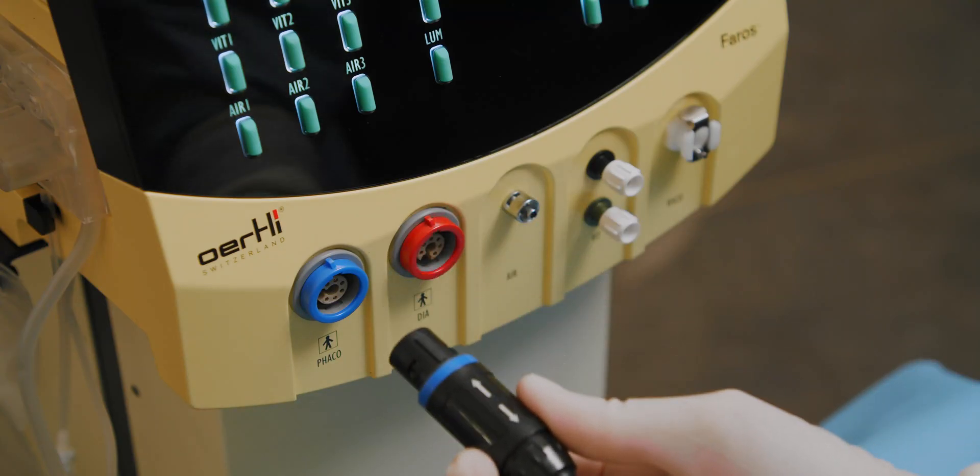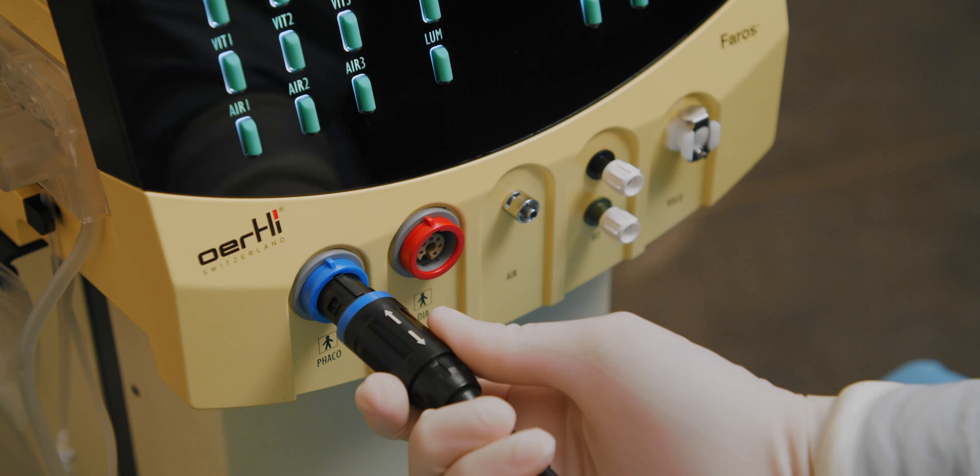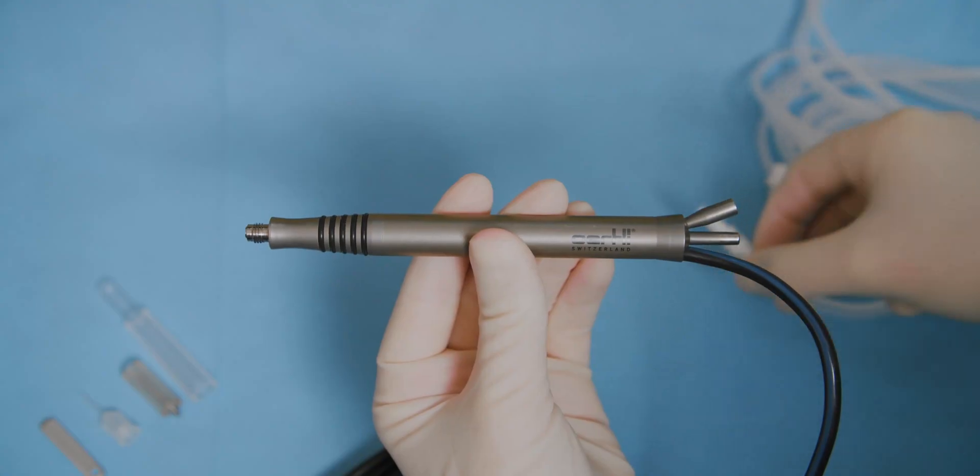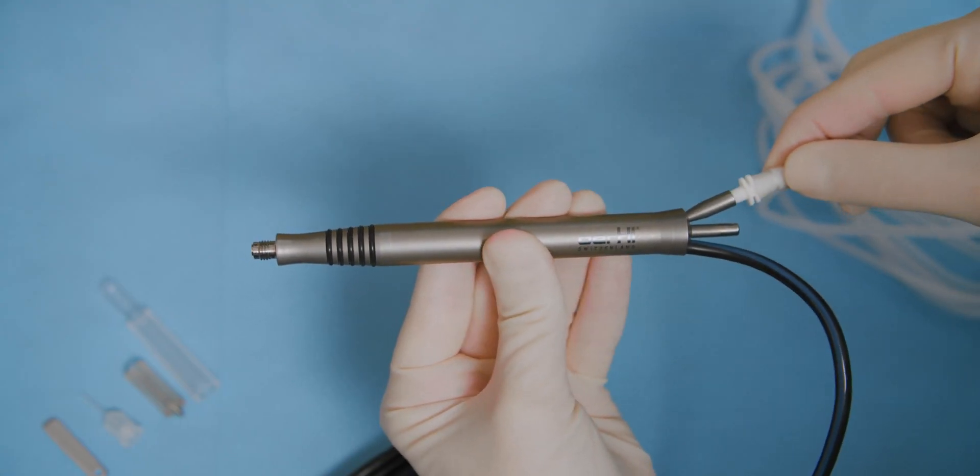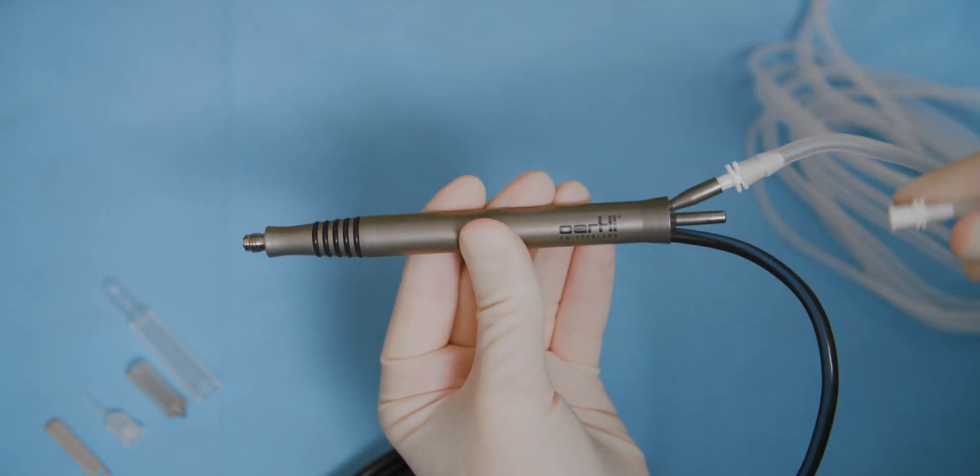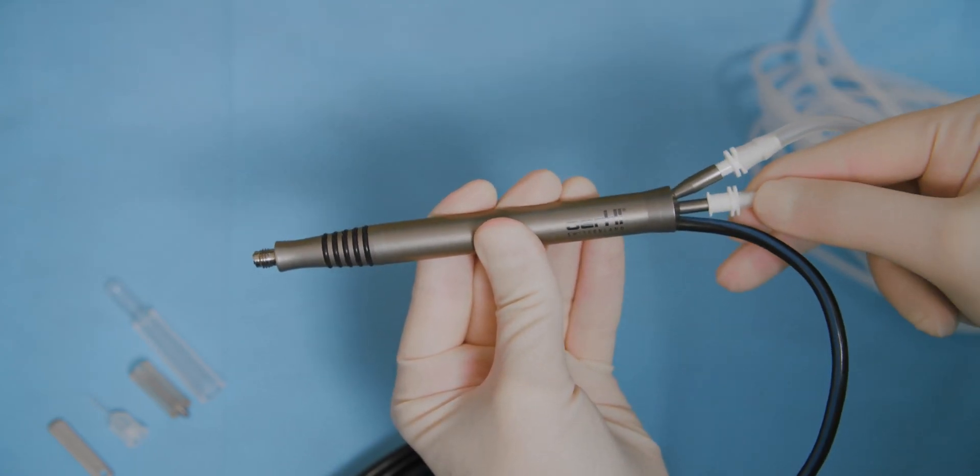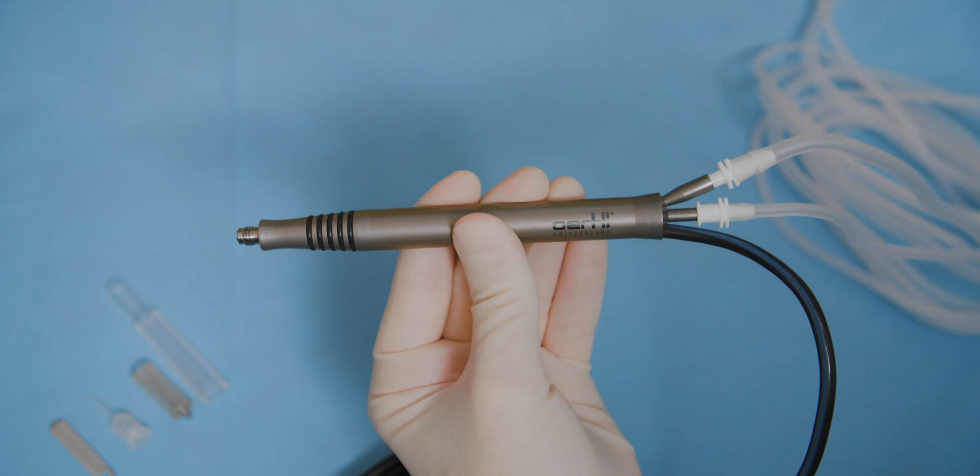Connect the Oertli phaco handpiece to the Faros. Connect the irrigation and aspiration lines to the ports on the phaco handpiece. Make sure that the connections are secure.